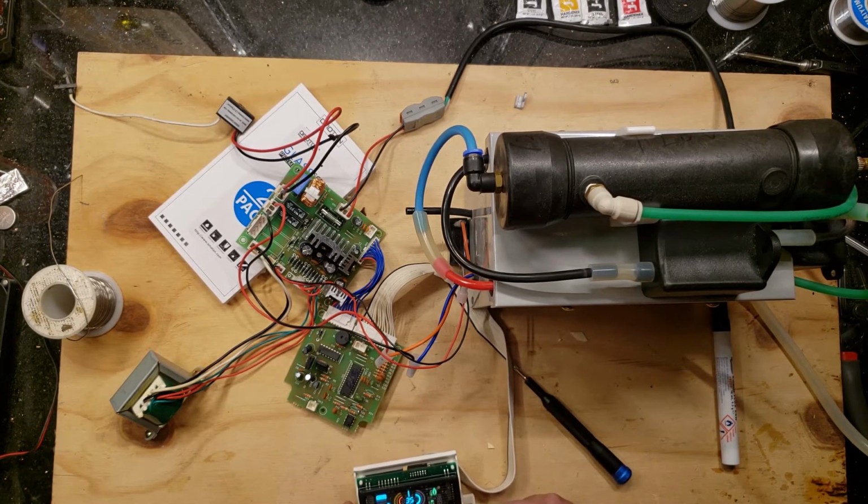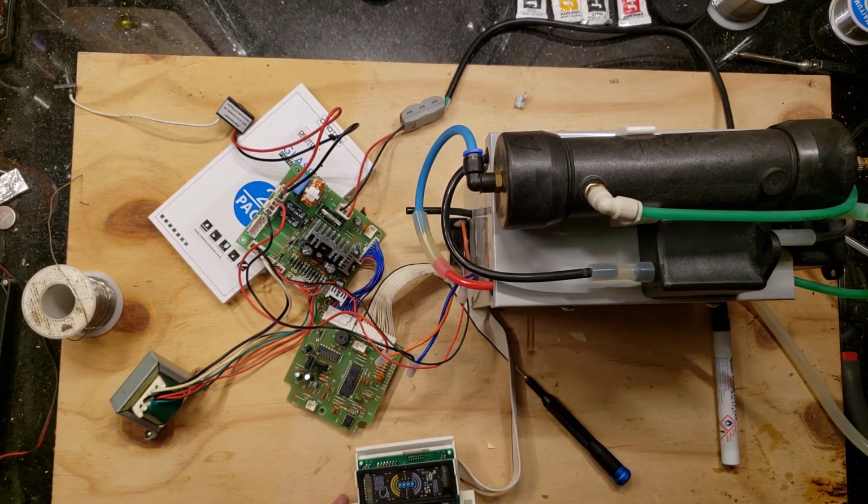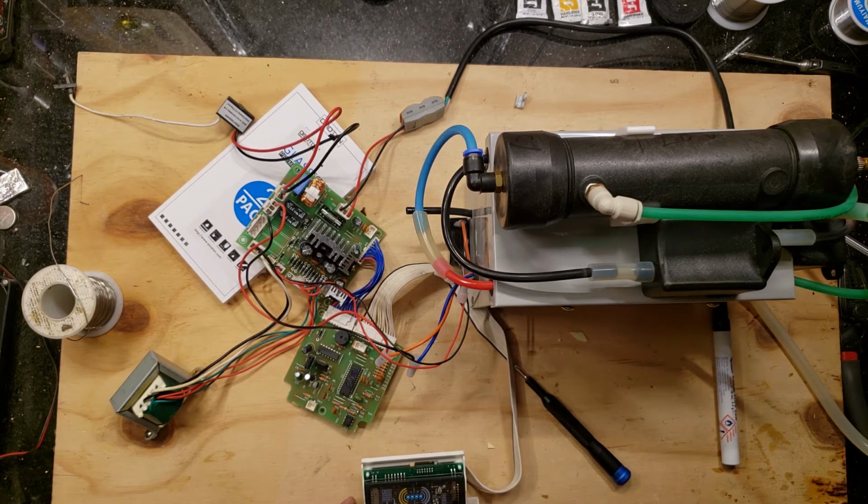Hey, the power button just worked. And the timer button works. And the manual button just works. I think I got it figured out. Should I just use this interface and just build a better box for it? I think that's what I might end up doing. I don't know. Nah, I think I could just build a timer for it, but it looks like all the functions are working.